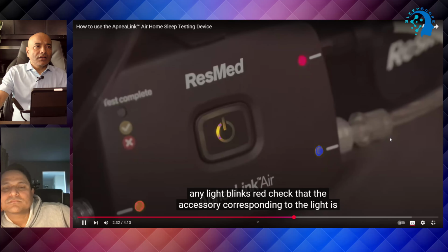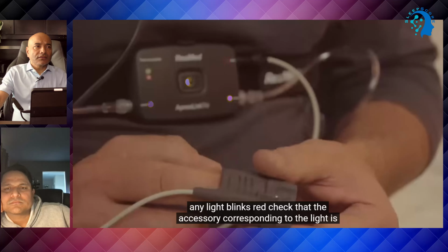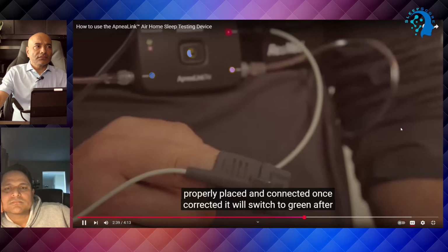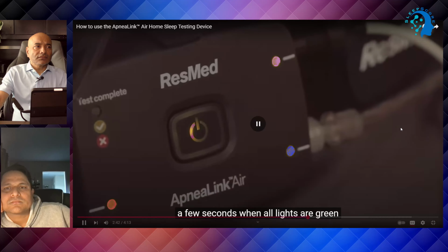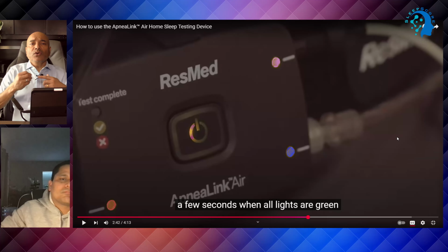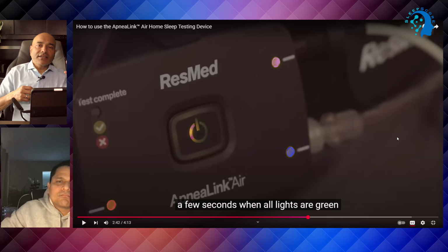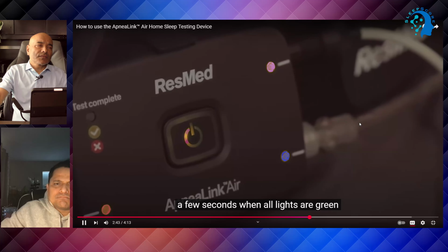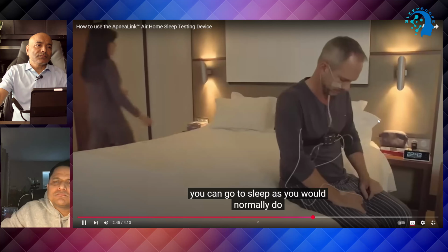If any light blinks red, check that the accessory corresponding to the light is properly placed and connected. Once corrected, it will switch to green after a few seconds. So whenever something is loose, those lights are going to blink red. When the patient is sleeping and it suddenly starts blinking red, the patient needs to understand it is loose somewhere. So he needs to fix it, either this one, or the nasal cannula, or the pulse ox. When all lights are green, you can go to sleep as you would normally do.